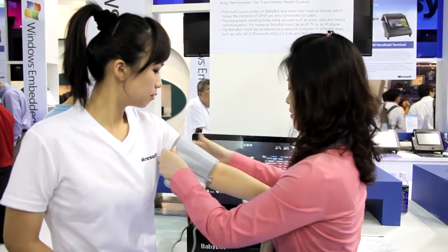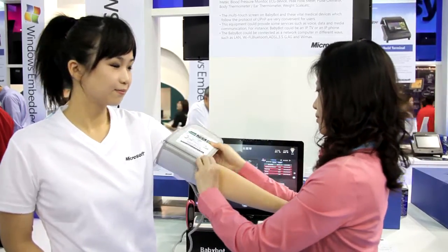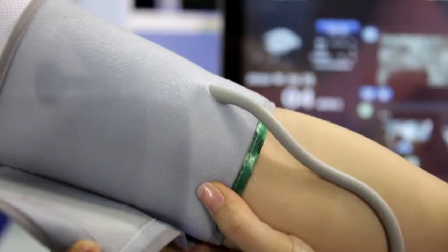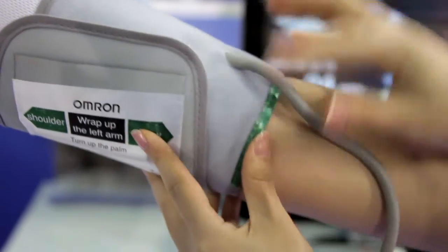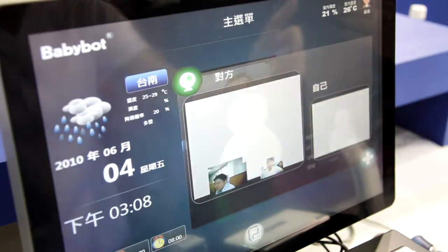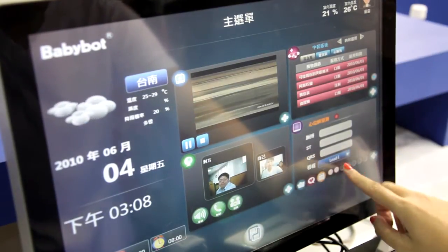Next step, remove clothing from your upper arm. Place your arm on the table so that the cuff is at the same level as your heart. Put your arm through the cuff loop, making sure that the bottom edge of the cuff is nearly 1 to 2 cm above the elbow, and let the green marker on the cuff sit above your brachial artery. Pull the end of the cuff so that it is evenly tightened around your arm and press the hook material firmly.